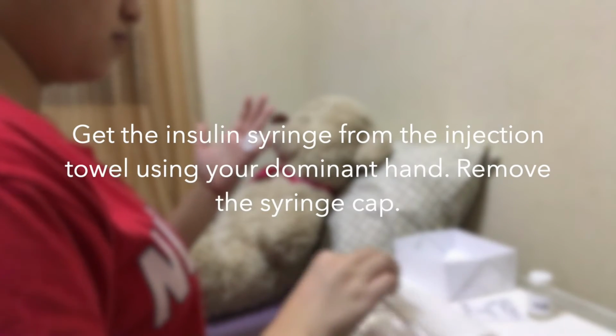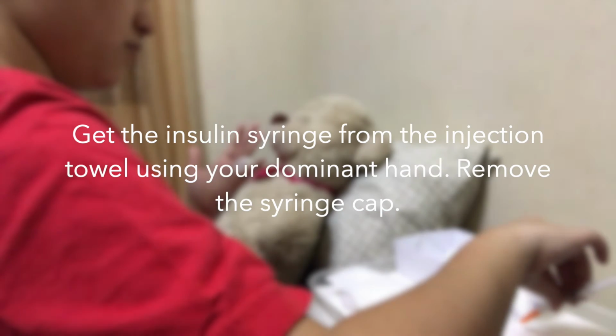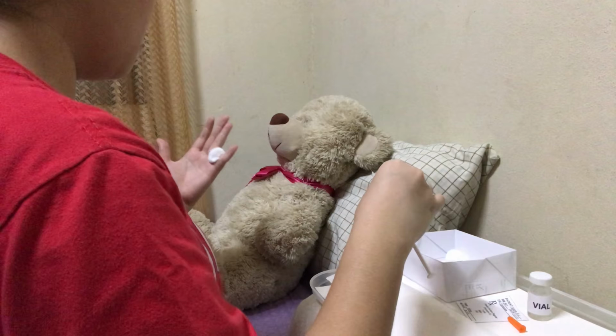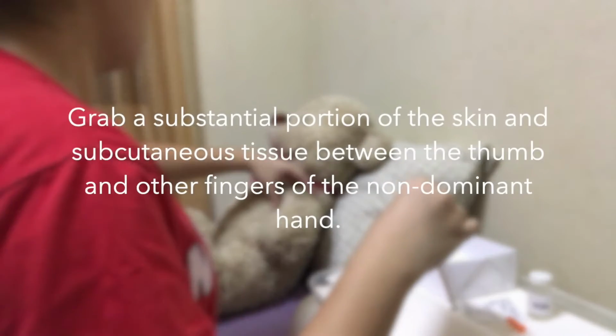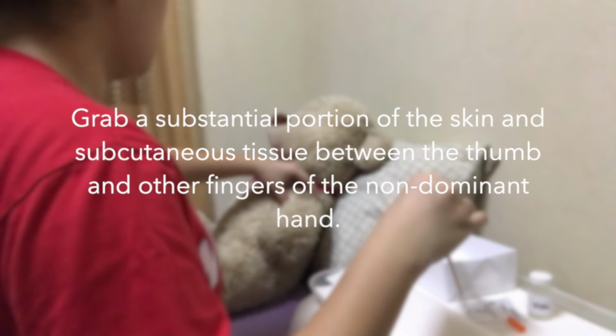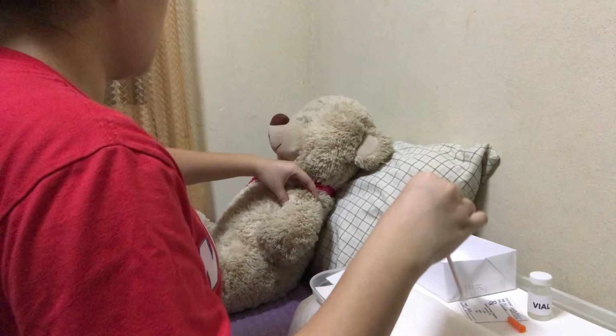Next is to get the insulin syringe from the injection towel using your dominant hand. Remove the syringe cap. The dominant hand is used to have a good grasp and control over the syringe. Next is to grab a substantial portion of the skin and subcutaneous tissue between the thumb and the other fingers of the non-dominant hand. This is to ensure that the insulin will be administered in the subcutaneous tissue.